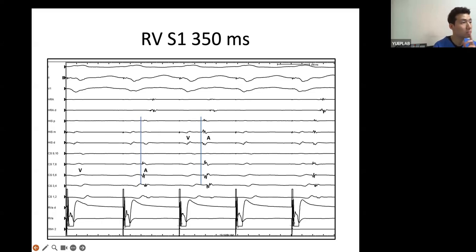Because the patient has what? Right bundle branch block. Okay? So right side input is delayed here. So actually the first bit is the fusion between fast and slow. The second conducted bit is only fast. The last bit conducted the fusion. Okay? That explains why the CS EGM is changing, the His bundle EGM is changing, all this.